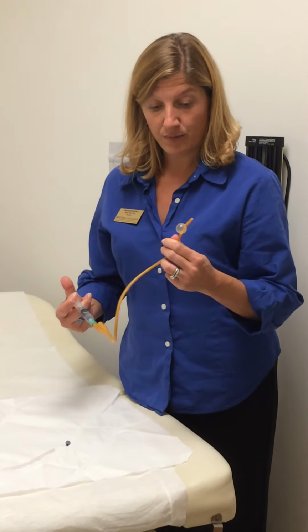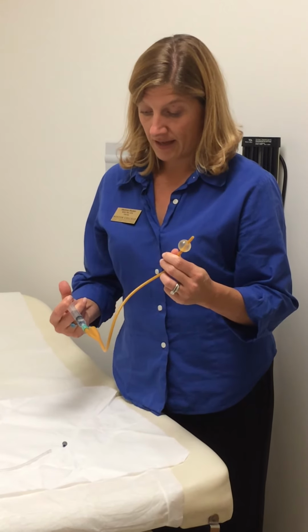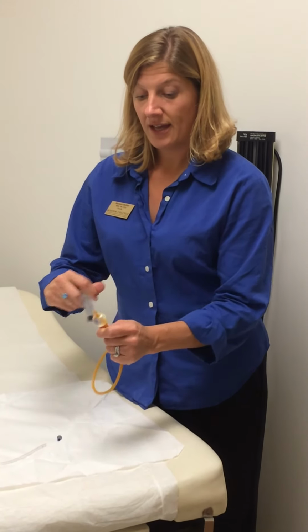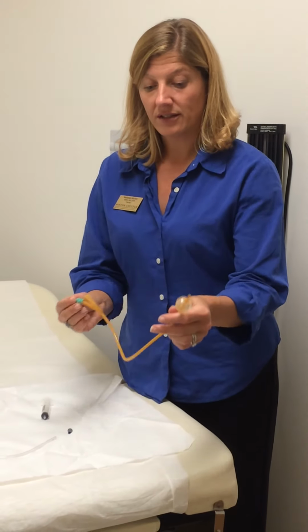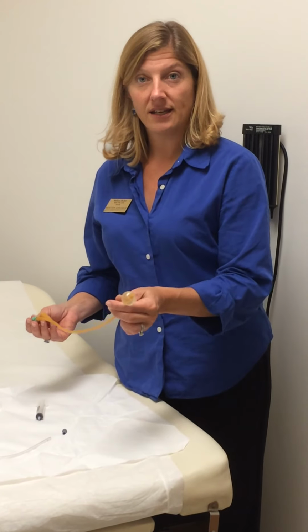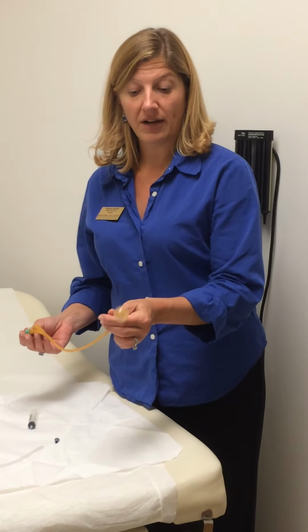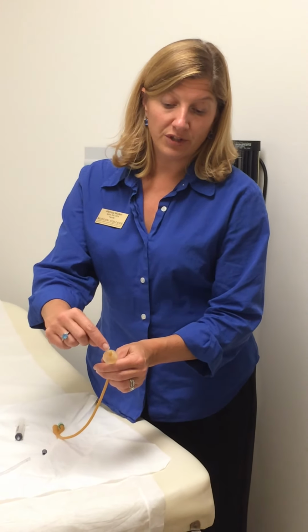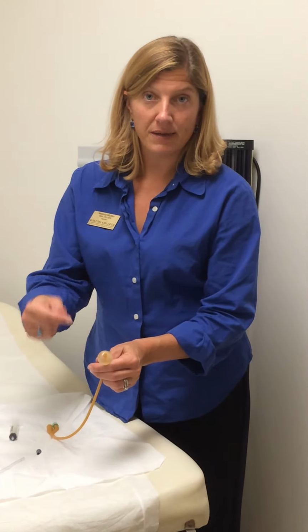As you can see, the balloon is clearly inflating. You want to put all of the saline or sterile water into the balloon, and now you let the tube slide back. This will rest against the bottom of the bladder, called the bladder outlet, right where it connects to the urethra, and this will continue to float right in the bladder, draining urine as it is made.